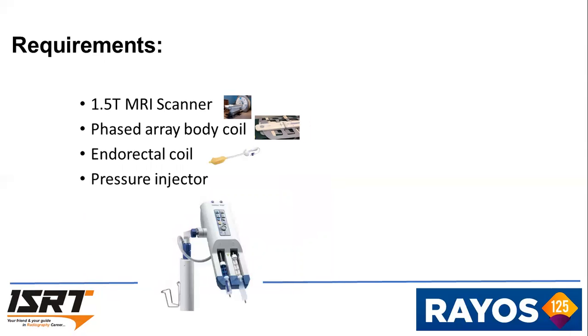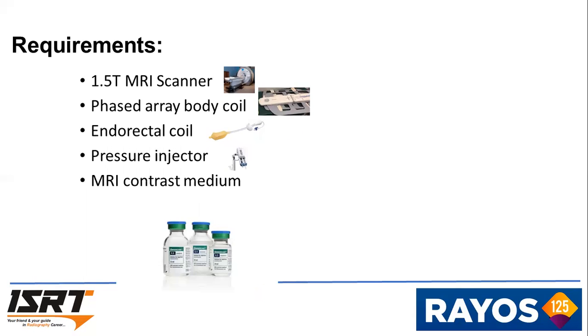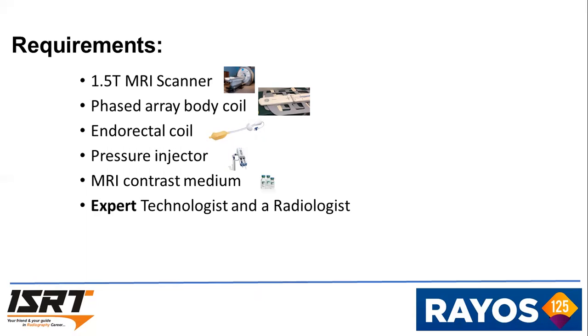Then a pressure injector to give contrast medium in a desired volume and flow rate according to the need. Gadolinium-based MRI contrast medium is required, and of course, an expert technologist and a radiologist.